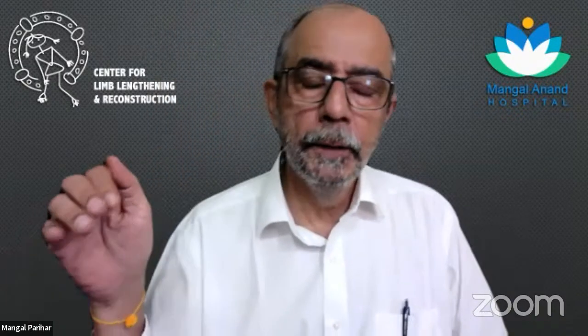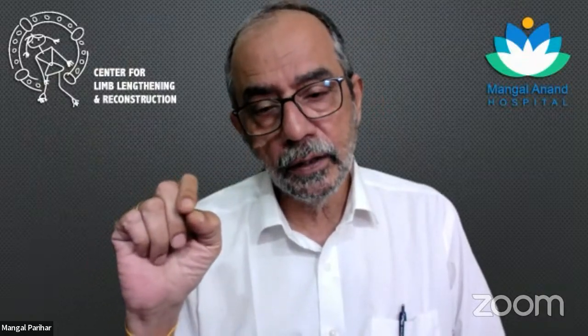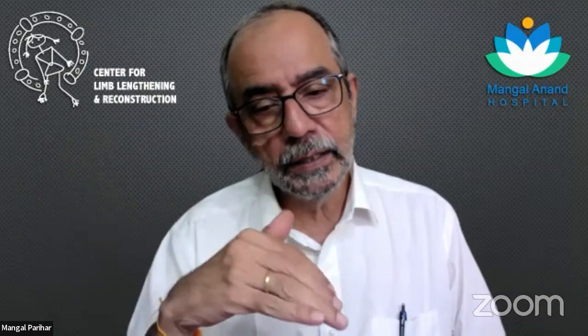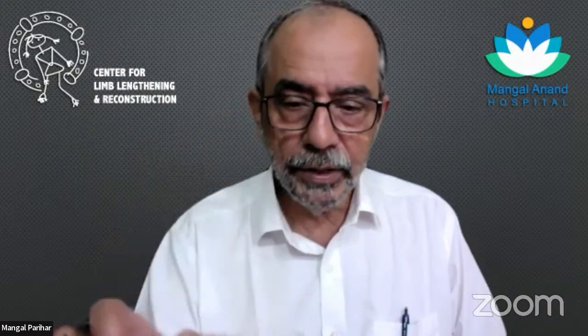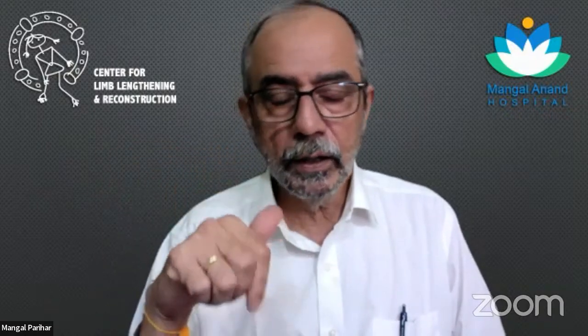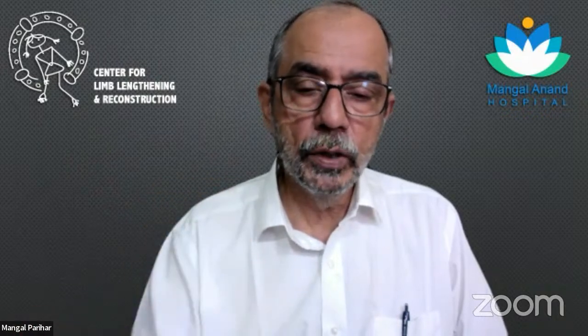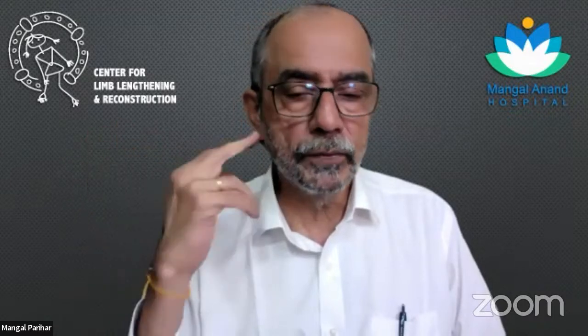It's going into cortical area. Yes. There is a risk of breaking that because you're doing a large correction, and then you have to fix that when you do a distal, you have to fix it with screws. So there is definitely a risk of fracture. Whereas the proximal is, as Sanjay showed, in metaphyseal bone that starts healing within about 3 weeks. So I will certainly not suggest that routinely we should do a distal osteotomy. It should be done in really cases where there is a problem in terms of correction. Okay. Thank you very much, sir.